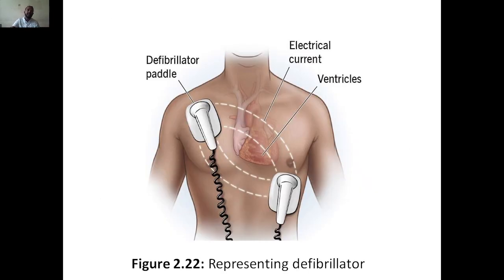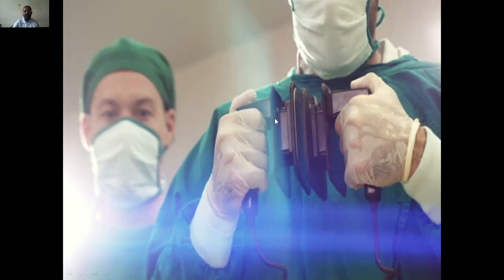So this is exactly what the defibrillator looks like. These are the paddles, okay. These are the paddles he is holding now. Here the electrodes will be there, here the shock will be given, okay, and these are the connections, the electronic circuitry, where the power supply will be given from the battery.